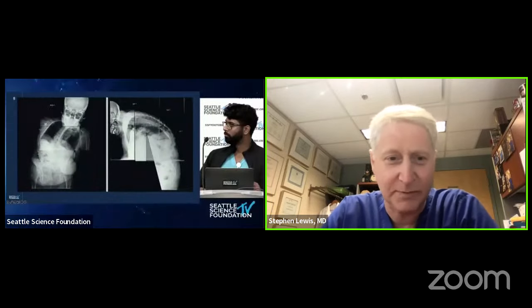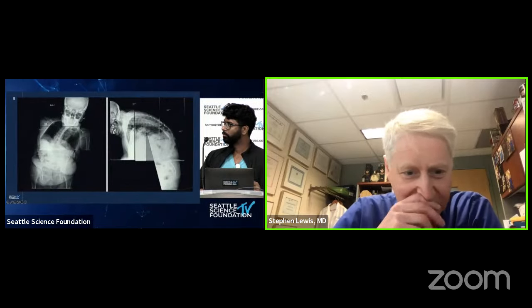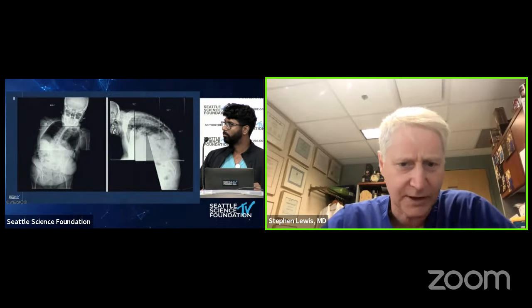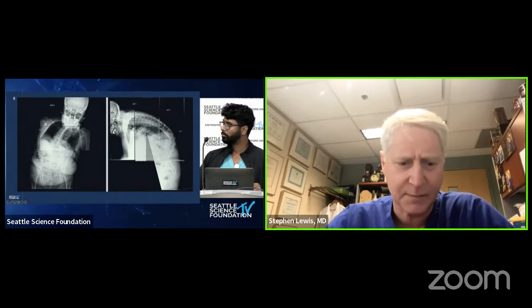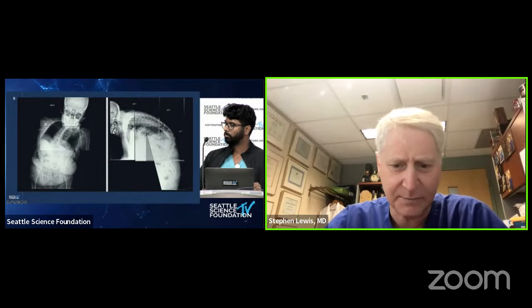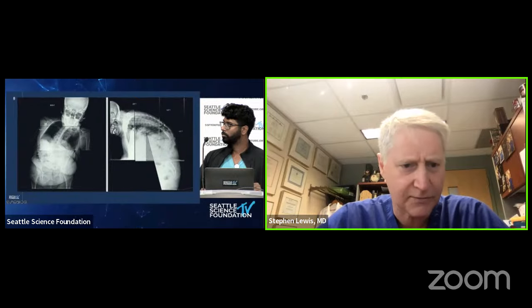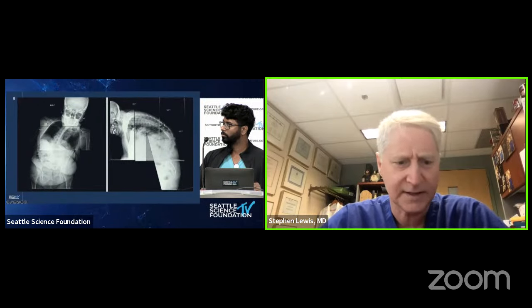I mean, I agree 100%. I thought for sure from the x-ray it was maybe an ankylosing spondylitis-type picture, but then clearly on the CT it is not. I think this is a classic camptocormia, and usually very high on the differential is Parkinson's. So you may have some sort of non-Parkinson neuromuscular disorder, but it's not usual for someone with a small deformity to stand in this position.